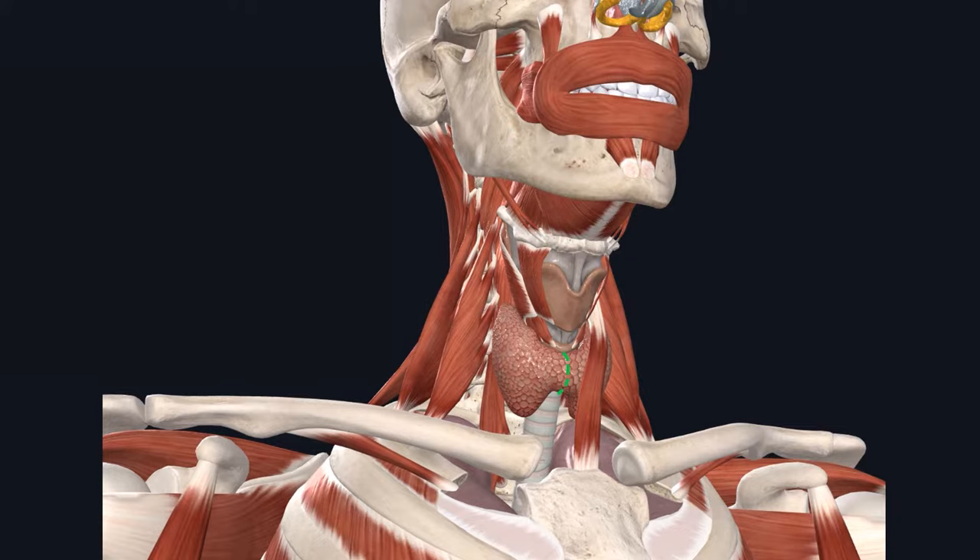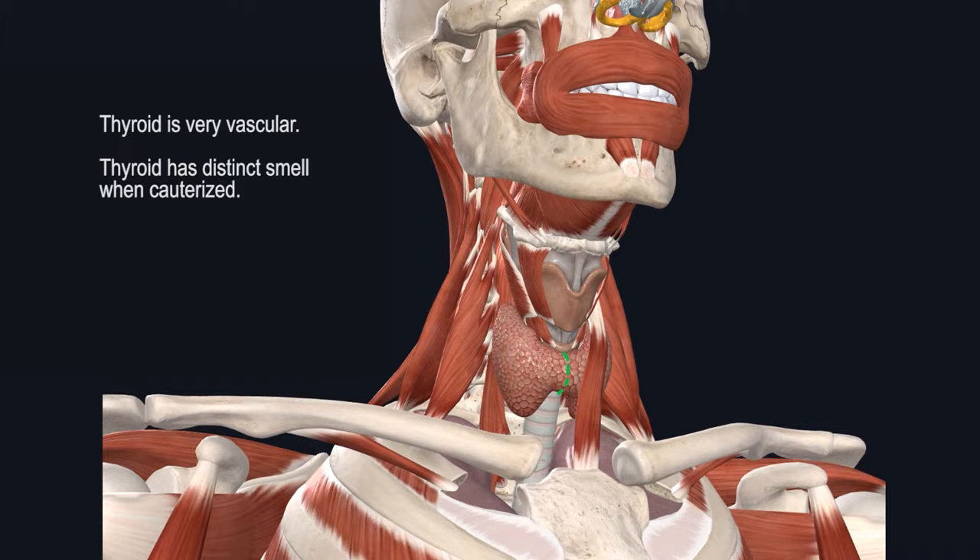Once you go through the strap muscles and dissect inferior to the cricoid, the next structure you'll encounter is the thyroid gland, depending on the size of the thyroid isthmus. The thyroid gland is quite vascular in nature, and if you inadvertently bovie the thyroid gland, it will have a sweet smell that is different from surrounding muscle. In certain cases, this distinct smell may help you identify the thyroid gland.